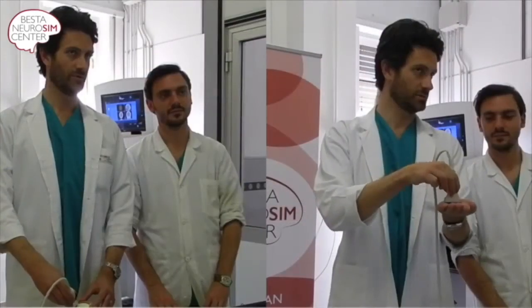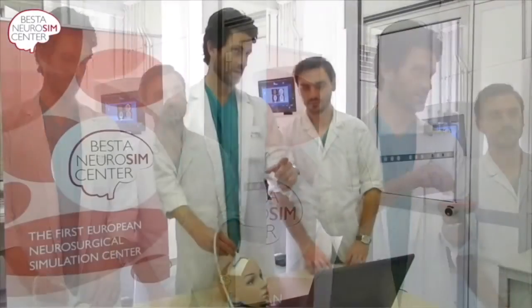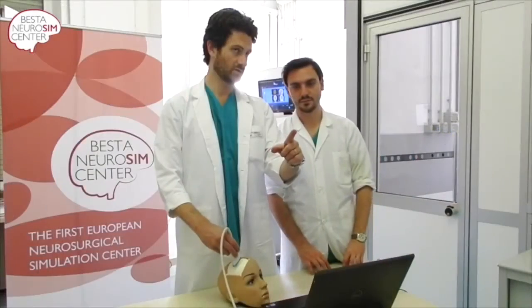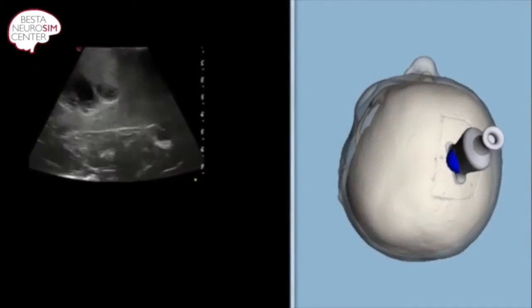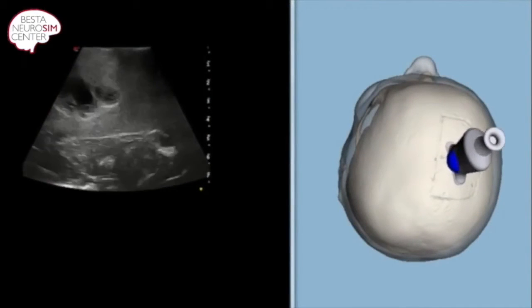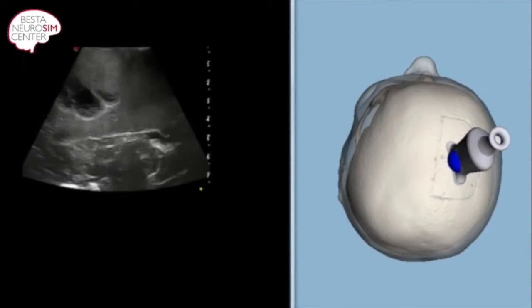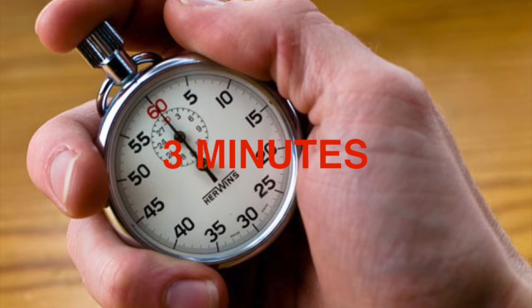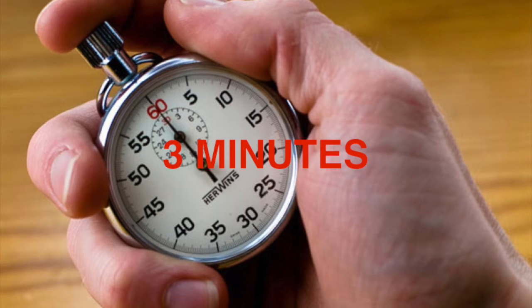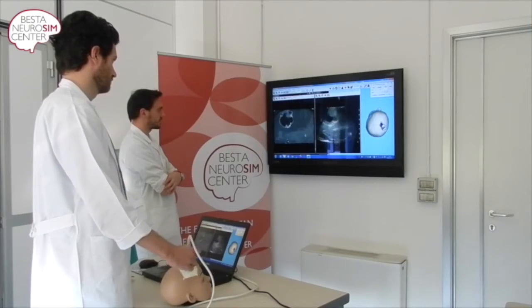You will visualize the brain in B-mode US. You will be asked to move and orientate the probe in order to identify and name some key structures of the brain and of the tumor. You will have three minutes to complete this part.